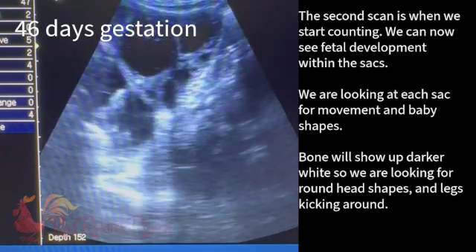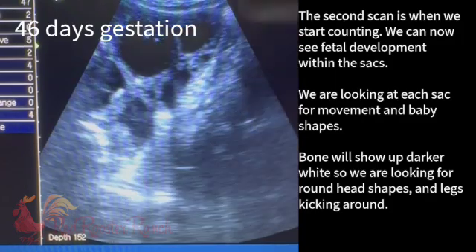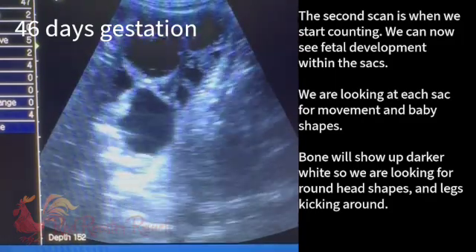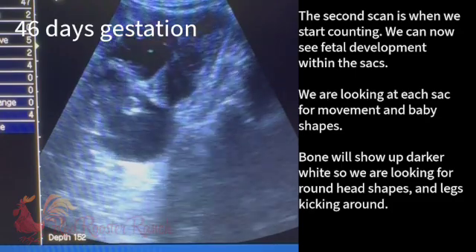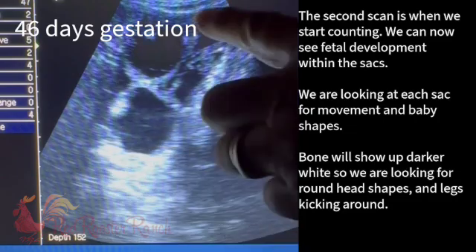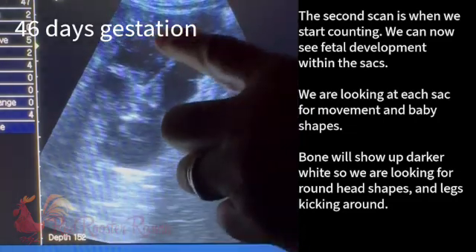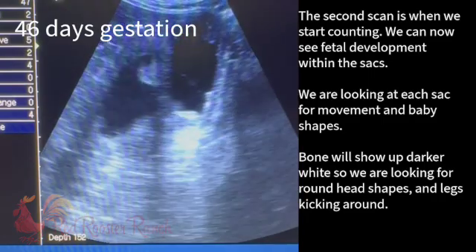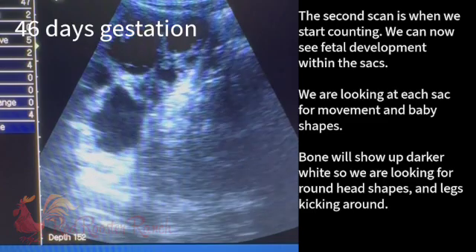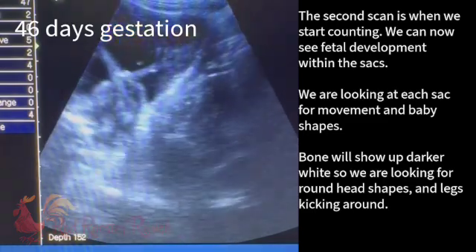The reason I like doing a count at 45 days and then sometime between 55 and 60 days is because it's harder at this point for them to look like one baby. Once you get over 52 days probably, sometimes one baby can look like two because they're so big — it'll look like two sacks, but really it's just some tissue. The baby's so long it's taking up both sacks. So putting the data together between the 45 and the 60 is really helpful.